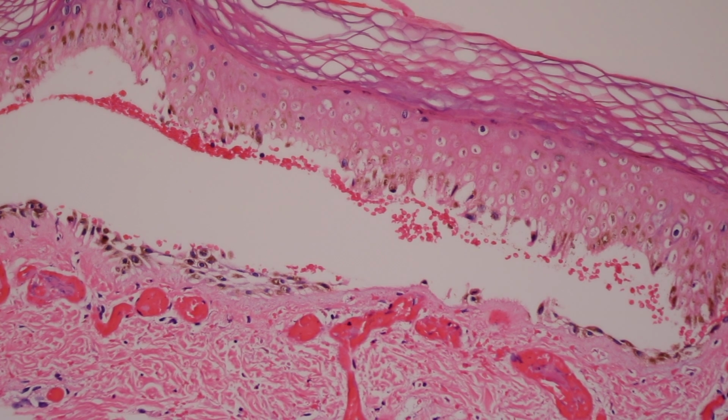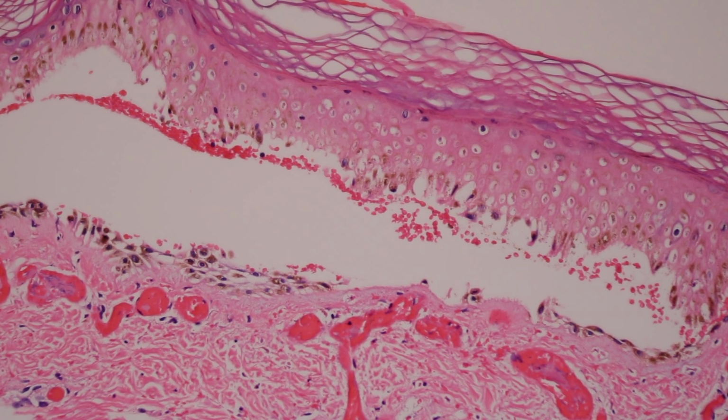But what happens is that the nuclei break down first, and so you'll see the loss of the nucleic acid, so the nuclei don't look purple anymore. And then the cytoplasm still looks pink because those keratin filaments are big, strong, intermediate filaments, big protein bundles filling up the cytoplasm. It takes a long time for those to be eventually broken down and destroyed, so they are much more sturdy and will stick around even well after the tissue itself is totally dead.